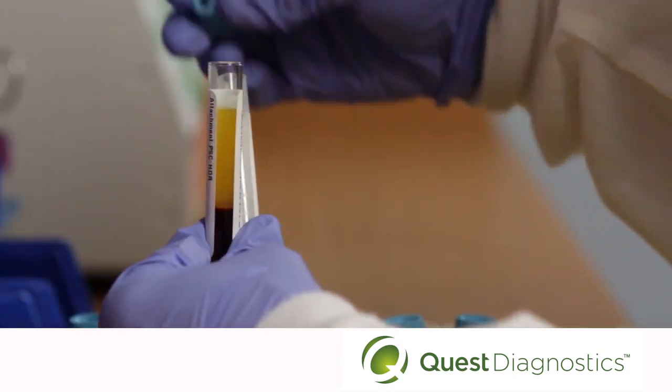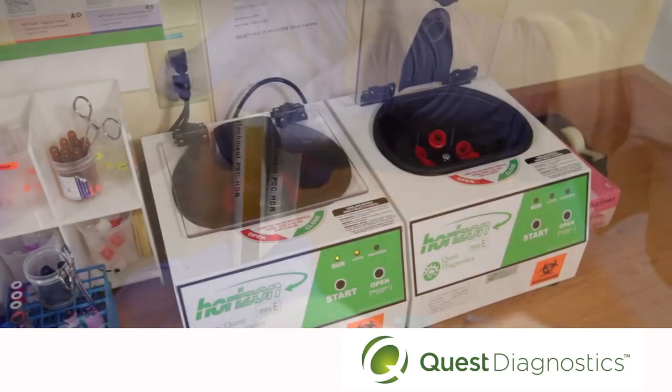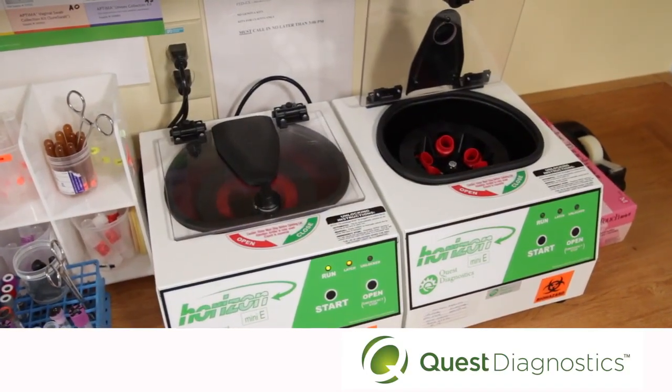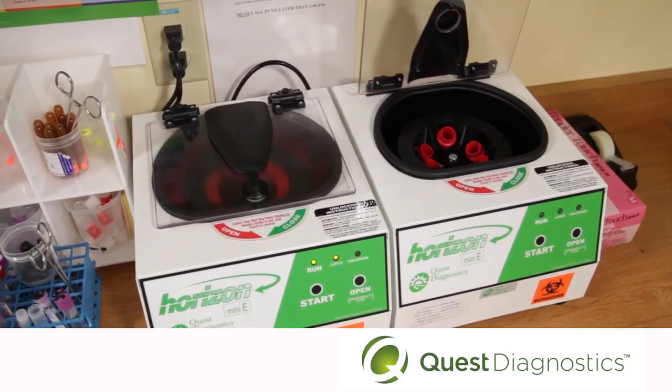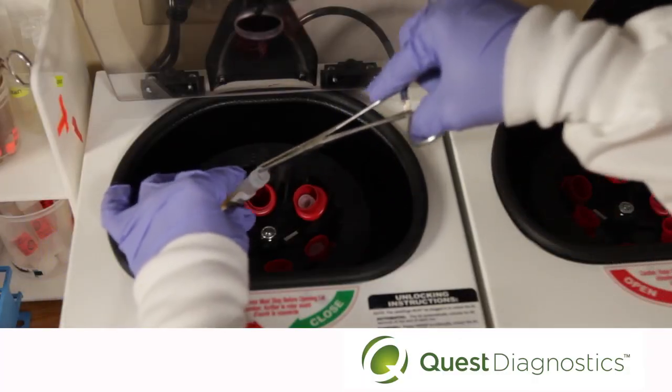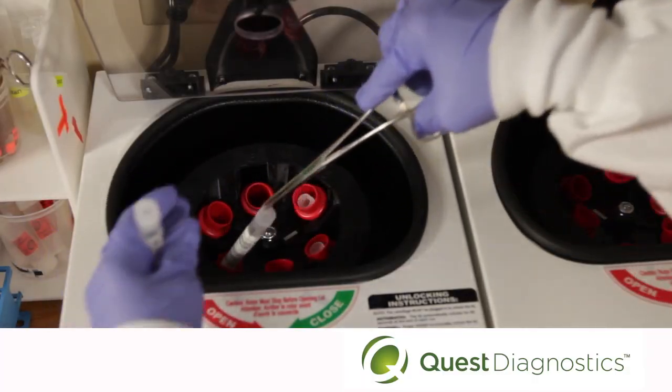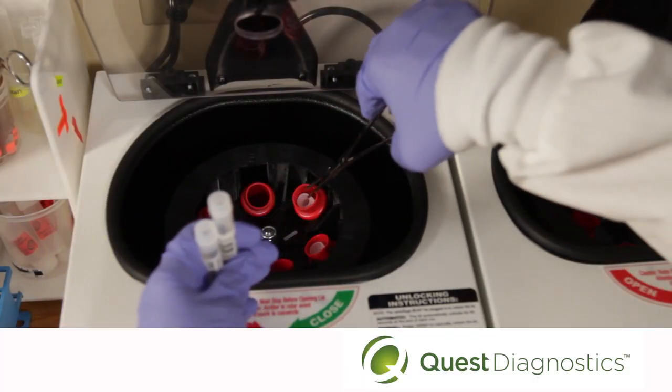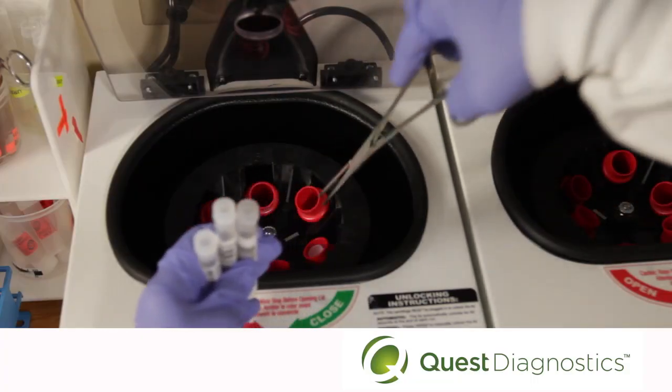There are no shortcuts in creating platelet-poor plasma. It is important that you perform a second spin even if your plasma looks good to the naked eye after the first spin. Failure to spin the plasma a second time will result in too many platelets in the plasma, which interferes with testing.